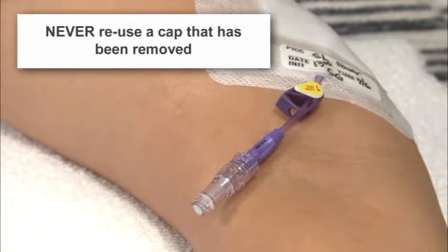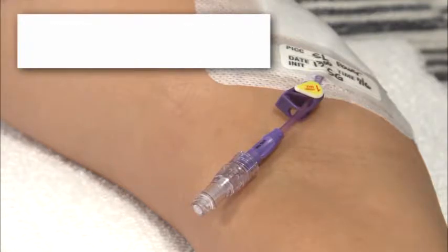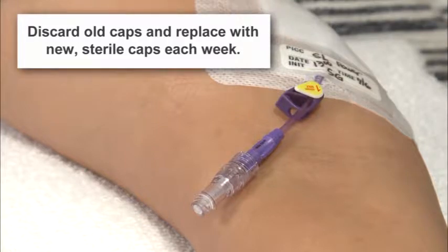Remember, never reuse a cap that has been removed. Once the cap has been removed, it is no longer sterile. Using it again could introduce germs into your catheter. Discard old caps and replace with new, sterile caps each week.